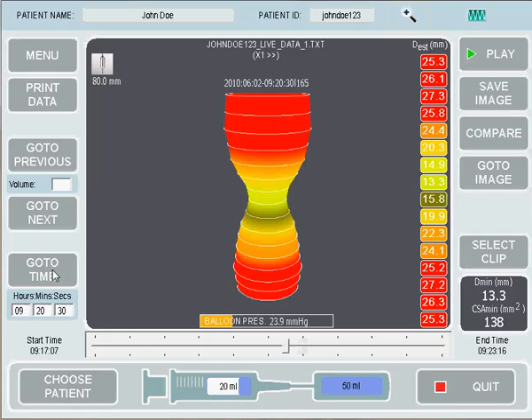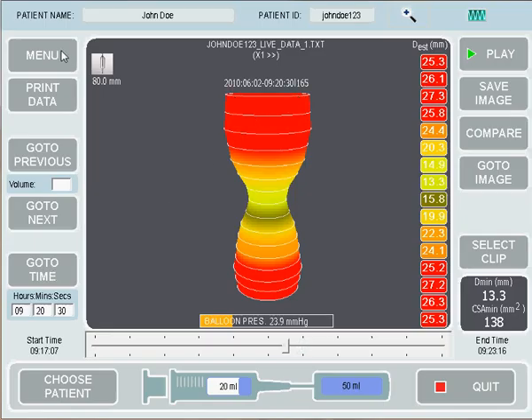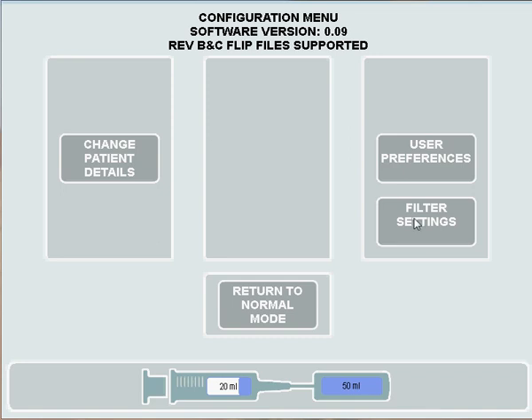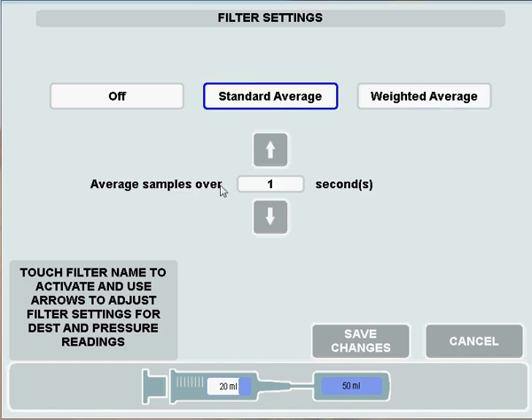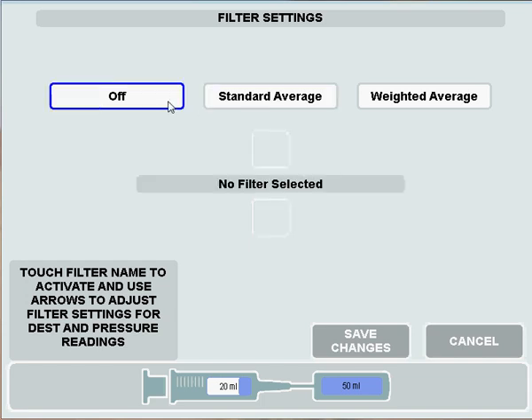If I pause the image and go back to the same time — 9:20:30 — and press the Menu button and Filter Settings, you'll see the different filter settings. At the moment I've selected a weighted average filter of High. I could also choose a medium or low filter, or decide to have a standard average filter and sample over a certain number of seconds using the up and down arrows, or I could choose to turn my filter off altogether.